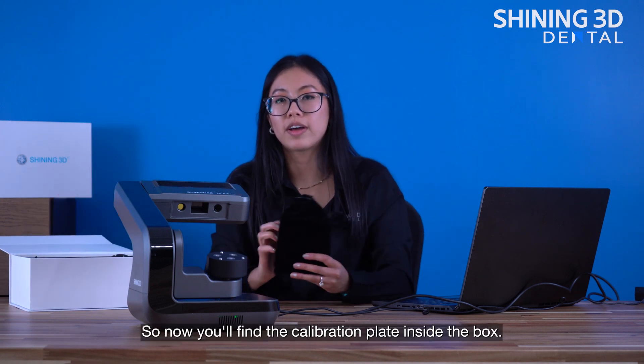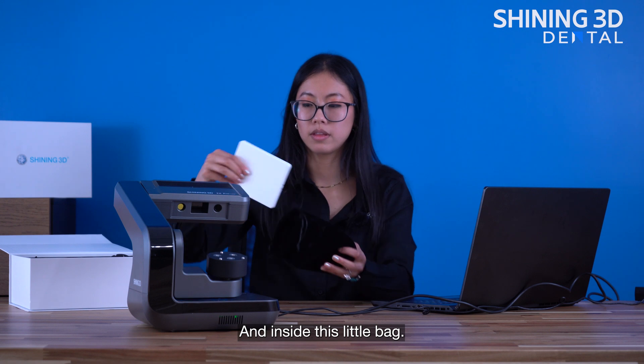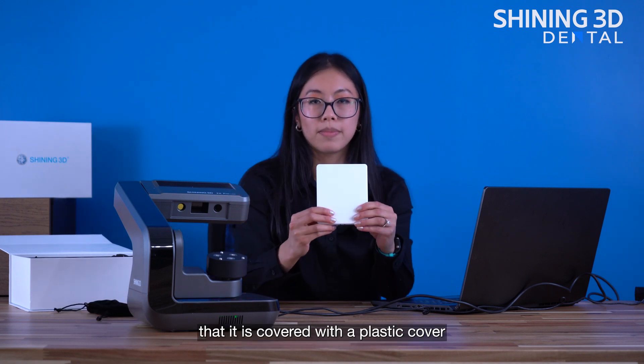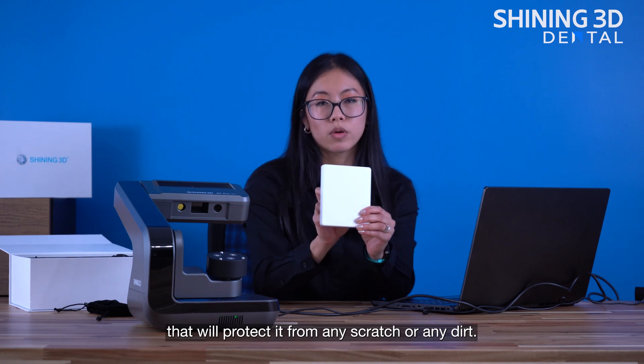Now you'll find the calibration plate inside the box and inside this little bag. You'll notice that it is covered with a plastic cover that will protect it from any scratches or dirt.